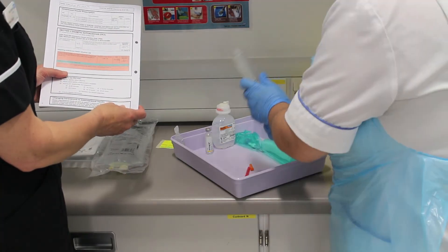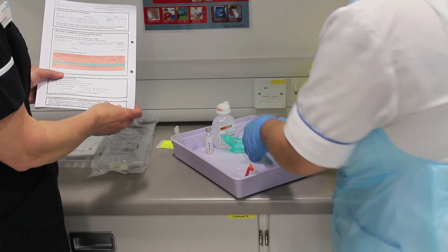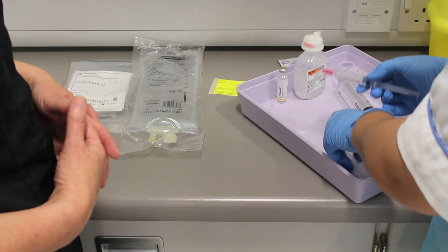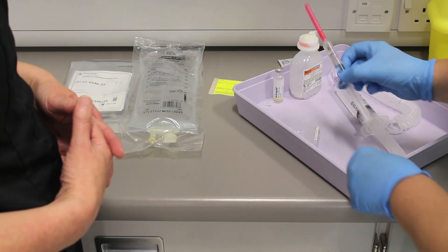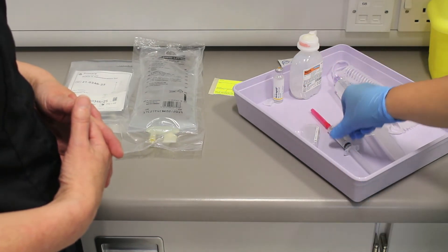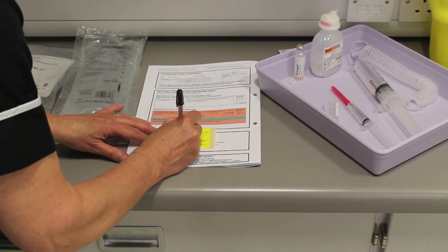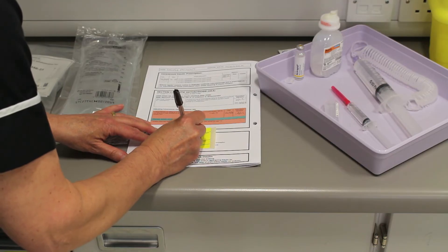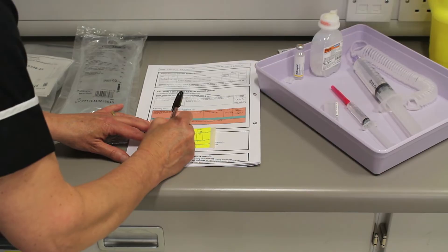Now connect your 50 ml syringe to the curly extendable administration line and return it to the tray. Prepare a sodium chloride flush at this point just in case there are any problems with the patient's line at the administration stage. Complete the details on the drug infusion label including both signatures and attach it to the 50 ml syringe, taking care not to obscure the gradient markings so you can check the syringe is infusing correctly at regular intervals.